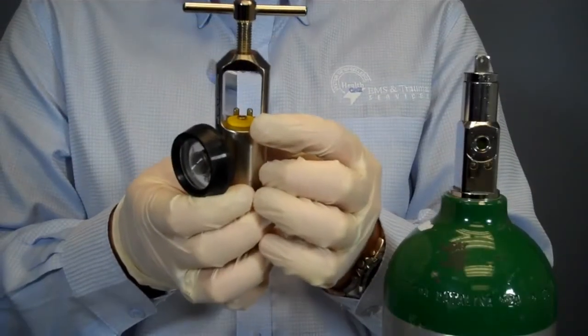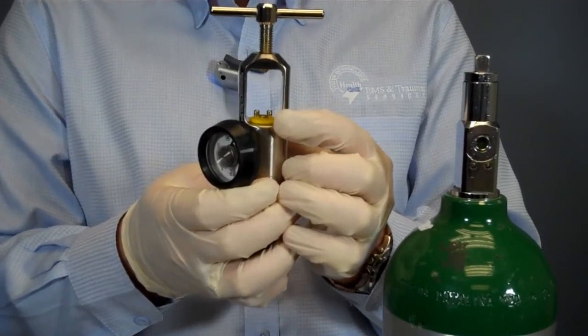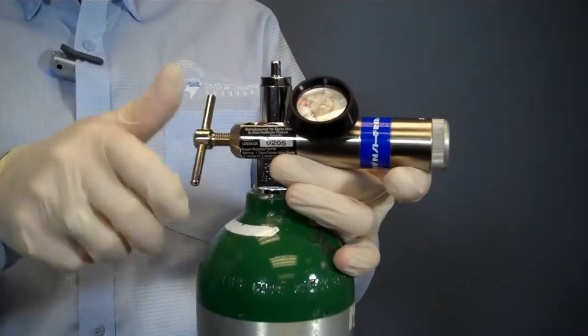Now I will assemble the regulator and the oxygen bottle. I will assemble the regulator onto the tank, ensuring the presence of an O-ring and proper alignment of the pins.